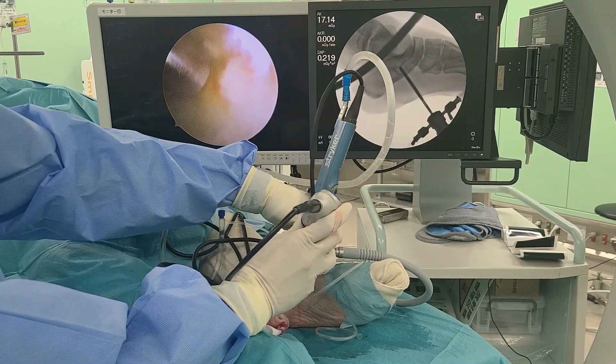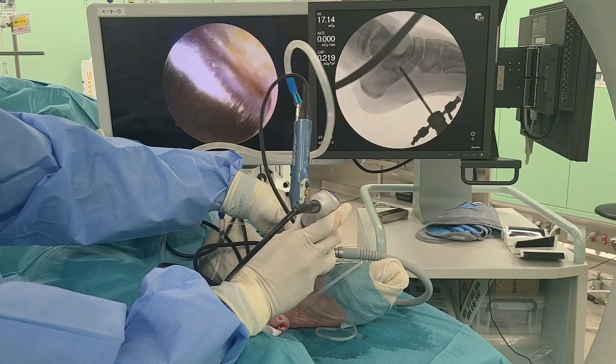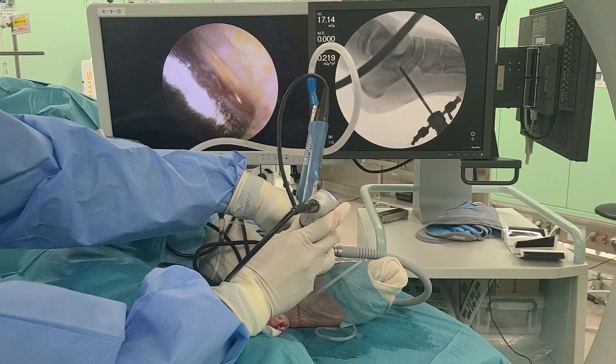The bone is yellow and the surrounding soft tissue is white; therefore, complete resection can be confirmed by the color.